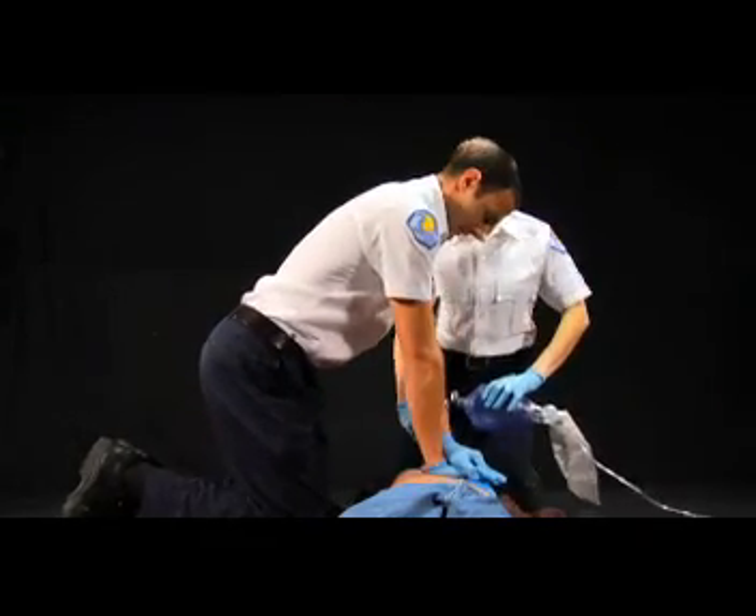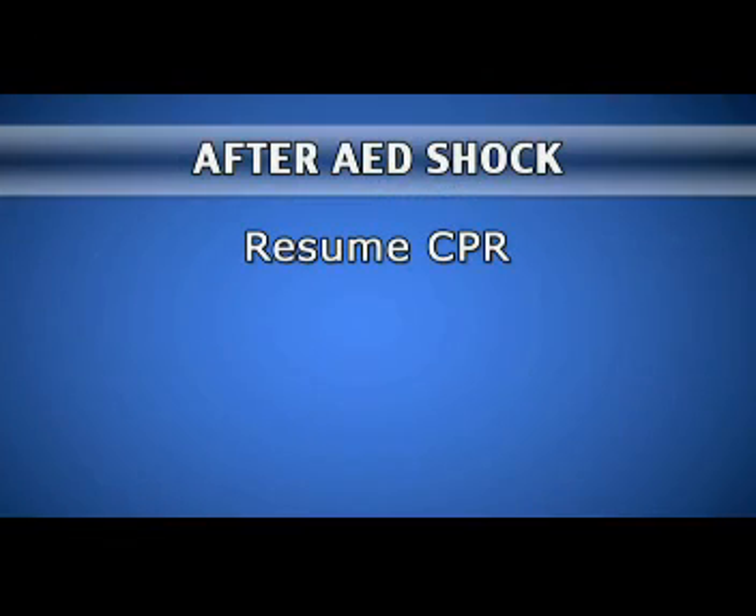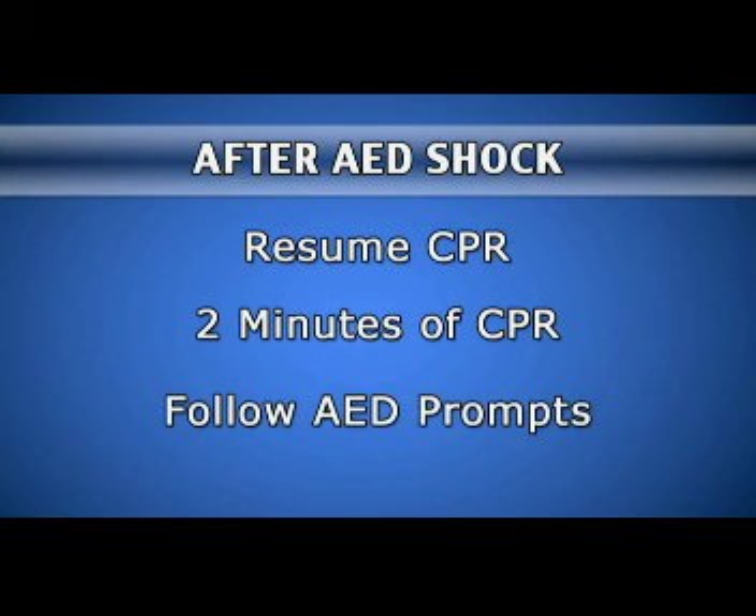After the shock, resume CPR starting with compressions. The AED will prompt you to immediately resume CPR after a shock. After two minutes, the AED will prompt you to stop CPR so it can analyze the patient's heart rhythm and determine if another shock is needed. Continue the sequence of two minutes of CPR and AED use until the victim begins to move, advanced rescuers arrive and are ready to take over, or no shock is advised. If the victim begins to move, place them in the recovery position and monitor breathing. Do not remove the pads.